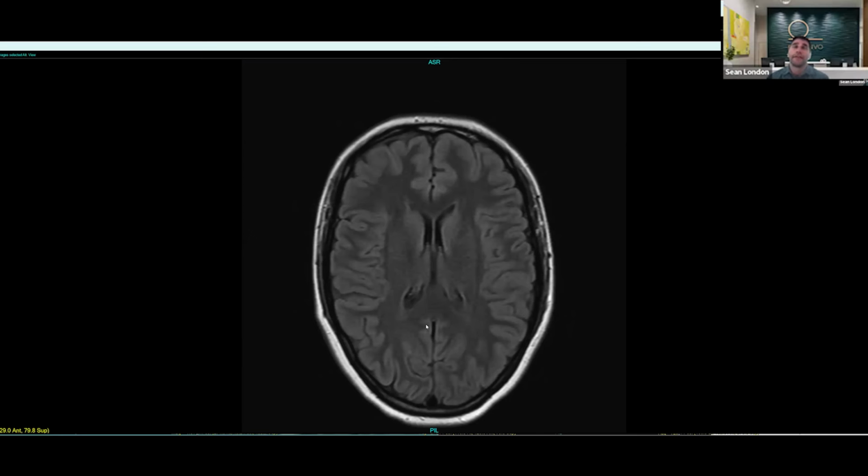Yeah, these arthroplasty implants, like the hips and the knees, I think they're pretty much made of titanium now, which is MRI compatible, meaning it's safe to scan. But they do cause artifact. Like when I was going through the exam and we were looking in the mouth, there was some dental hardware in there that was causing artifact, and that's very similar to what happens in the hips. And depending on where it's located, for the hips, it can create artifact and obscure the pelvic organs, so we may not get the best assessment. There are ways to try and mitigate the amount of artifact that's produced, but even with dedicated exams, you're still going to get some artifact.